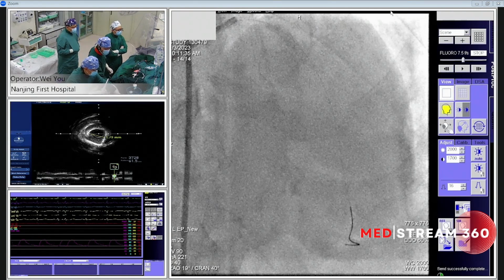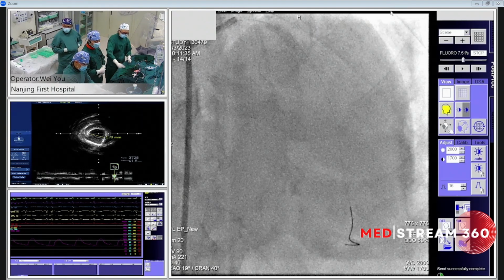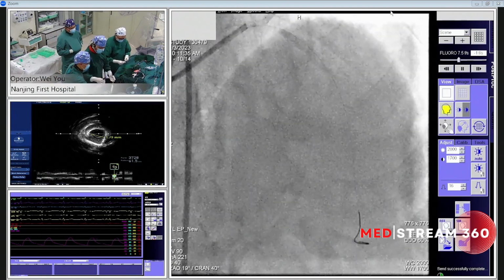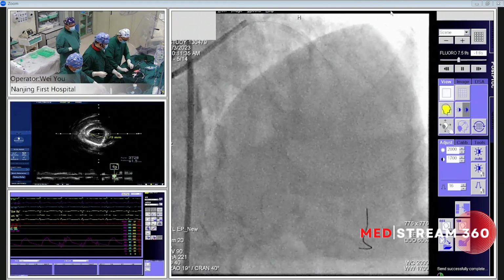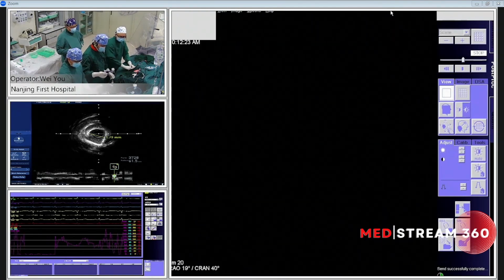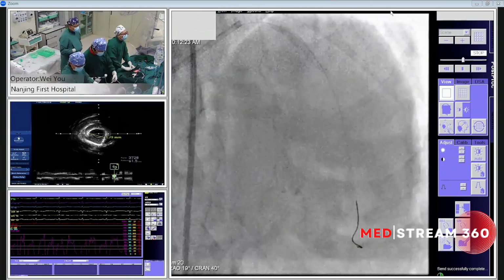Yeah, we agree. Dr. Fan just calculated the vessel diameter. 3.0, just the reference vessel size. So next step we'll do the IVL treatment with a 3.0 shockwave balloon. So it's a typical combined treatment with rotablation and IVL treatment for this severe calcification before we put the stent.